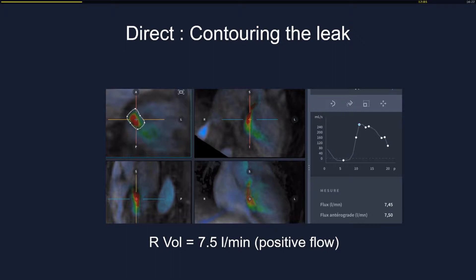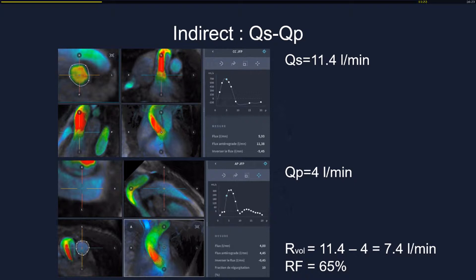Here is an aortic regurgitation example. I place the contour two or three centimeters below the valve to measure the leak with good confidence. The curve gives a direct reading of the positive flow: 7.5 liters per minute of regurgitation. However, this could be uncertain due to interference with mitral flow, so we are not yet sure of this first measurement.